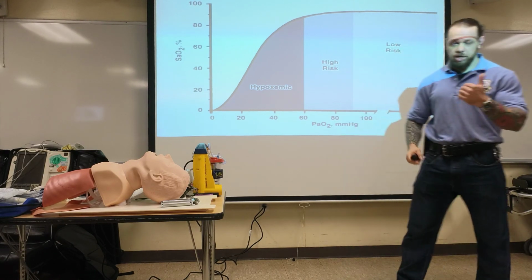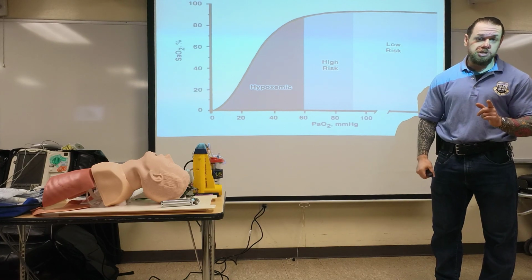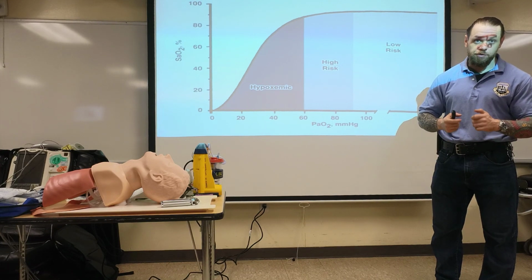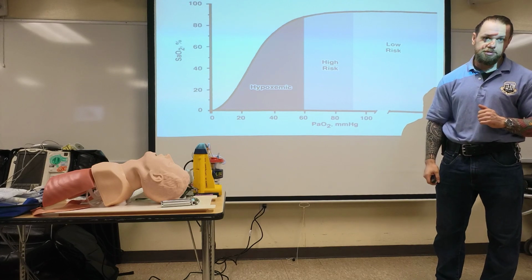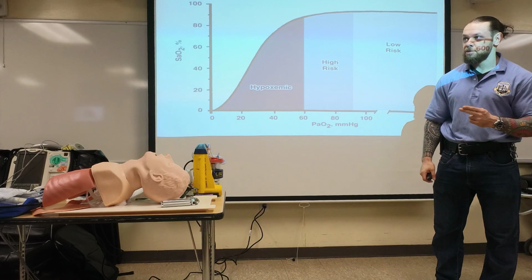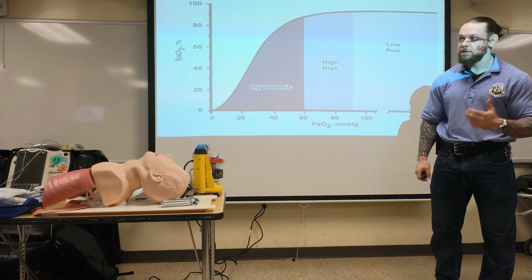So we're going to pre-oxygenate them for 2 minutes, and for this skill, this is very different. All the instructors, I want you to listen. They are to do this for 2 minutes. They're going to bag using that technique for 2 minutes that I'm showing them. They're not to bag one breath and say, okay, the pulse ox is 100. They're going to bag for 2 minutes, and if their technique is not proper, you're going to correct them. And if after the correction they're still not able to do it, they're going to keep practicing.